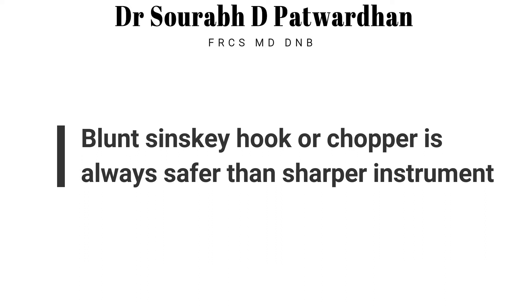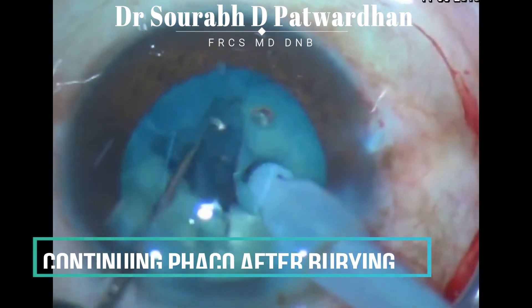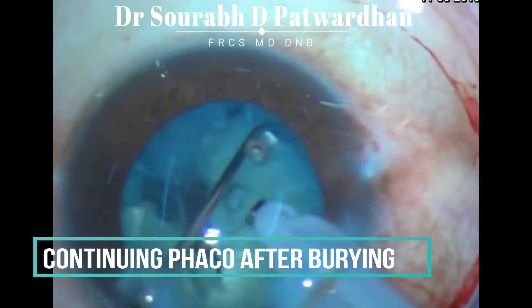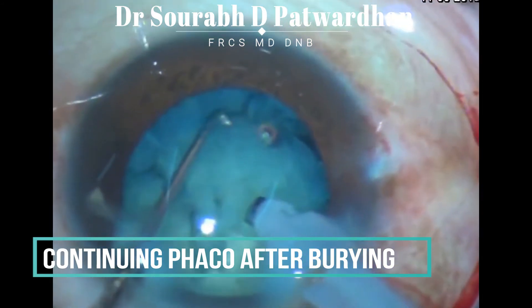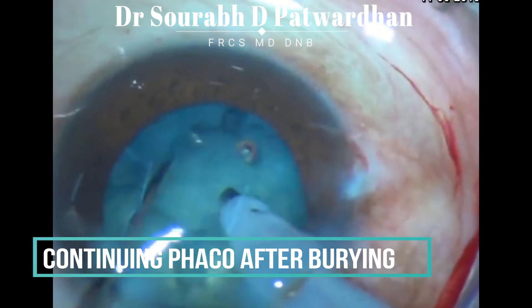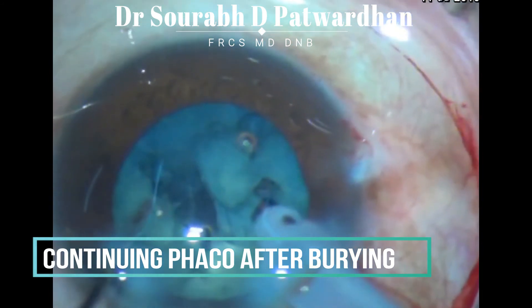A blunt Sinski hook chopper is safer than any sharp instrument. Never give feco once the tip is adequately buried, as it may cut through — like in this case. When you have already buried the tip in the nucleus and continue to give feco, it is going to create a hole through the posterior plate and damage the posterior capsule. So avoid doing that. Stop feco once the exposed tip is buried inside the nucleus.